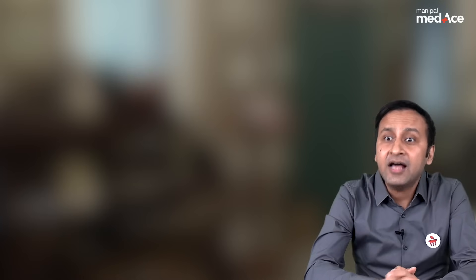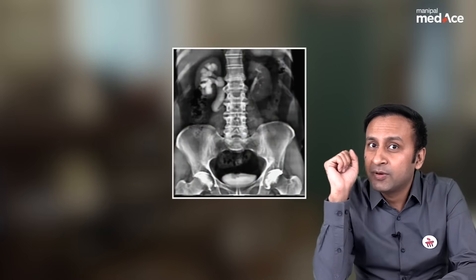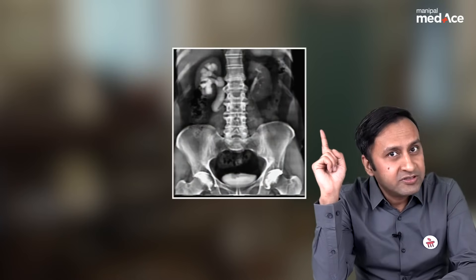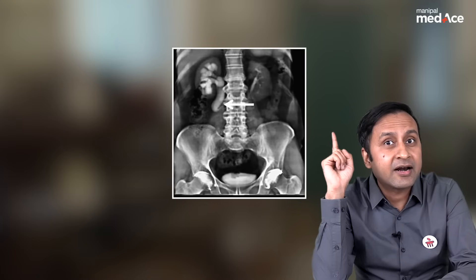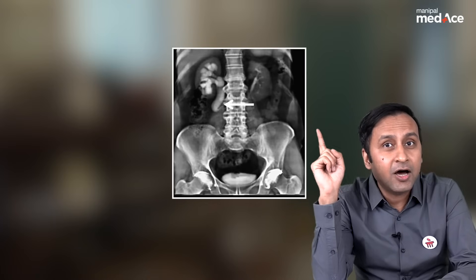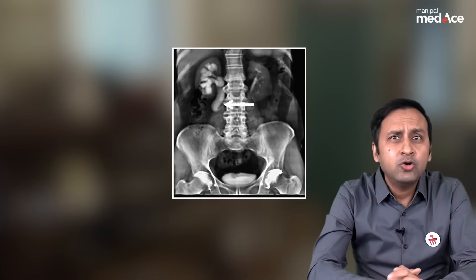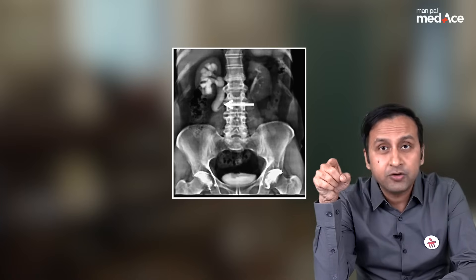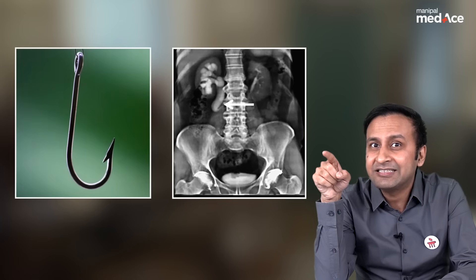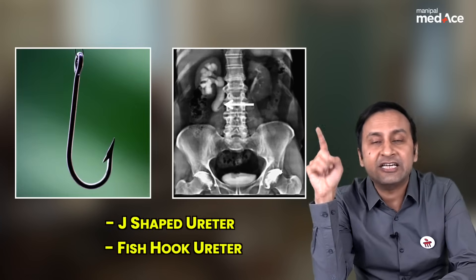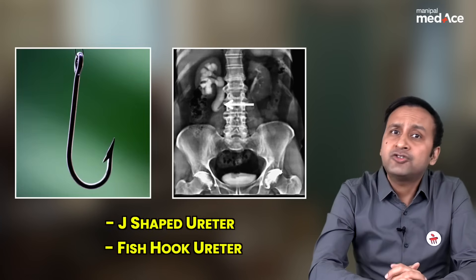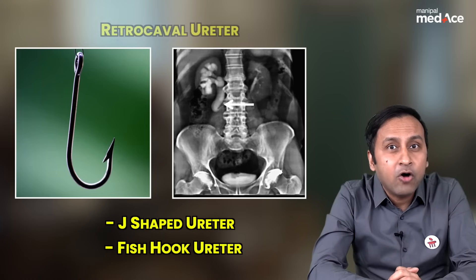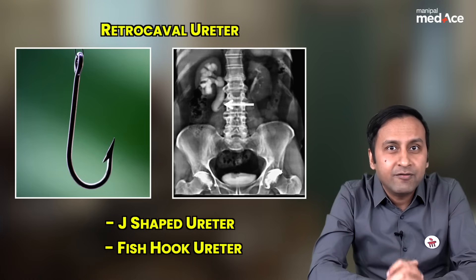Let's look at our third case. There is dilatation of the right ureter along with right hydronephrosis. Look at the shape of this ureter — there is abrupt narrowing and the ureter appears kinked, just like a fish hook or J-shaped ureter. This fish hook or J-shaped ureter is a classical example of a retrocaval ureter.